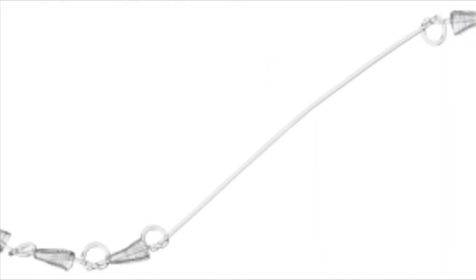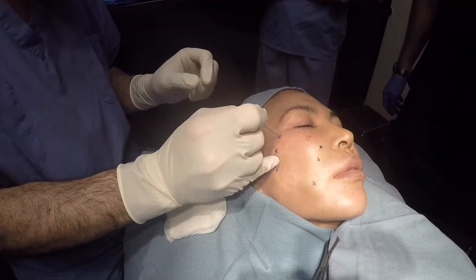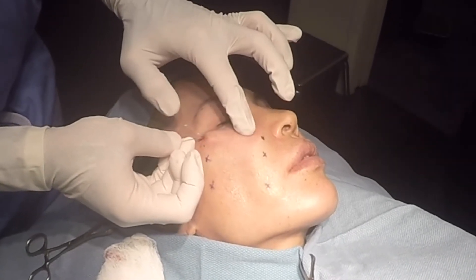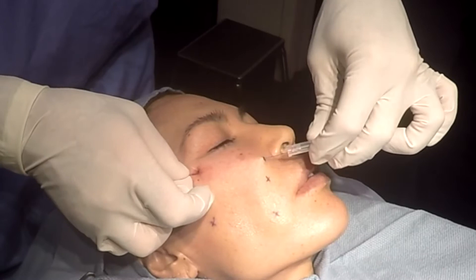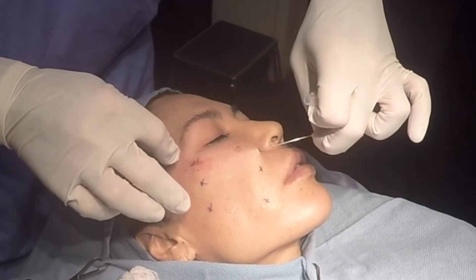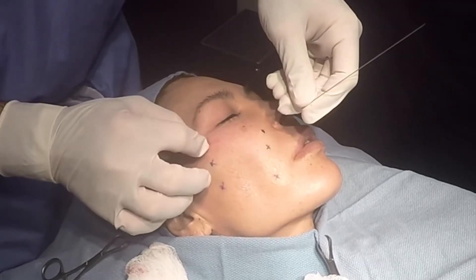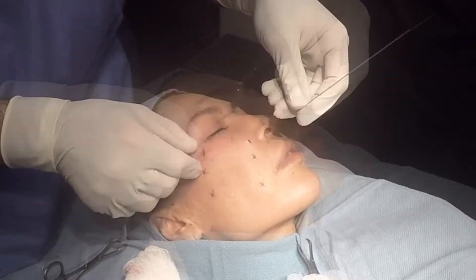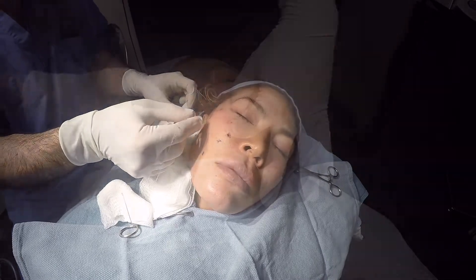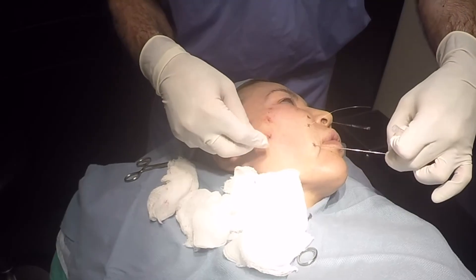The Silhouette InstaLift offers a minimally invasive solution to the aging process by achieving lifting in the mid-face through the use of fully absorbable suspension sutures with small smooth cones that are bi-directional at either end. A needle is used to insert the suture in the layer directly under the skin. Once implanted, the opposing orientation of the cones are used to compress and fix the loose facial layers in an elevated position to lift the lax tissues of the face.